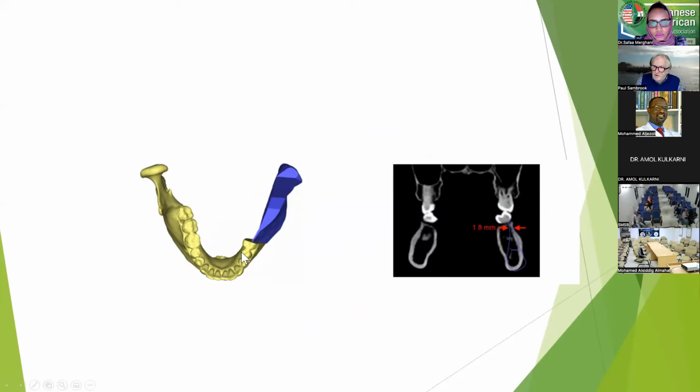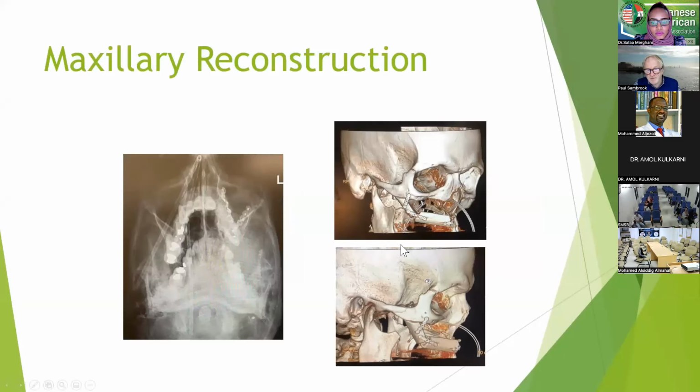And again, these are the sorts of things that you need to be able to discuss with your technician, with your computer technician that's going to do these things for you. Even though the lower border here may well be a really good thing, if you look at the way the mandibular teeth on the right side are inset, the left side here needs to be inset even further.